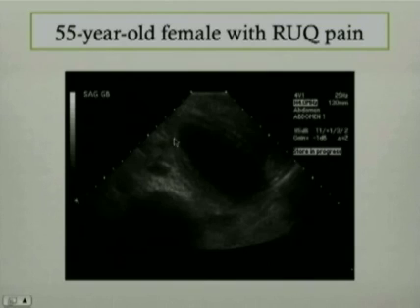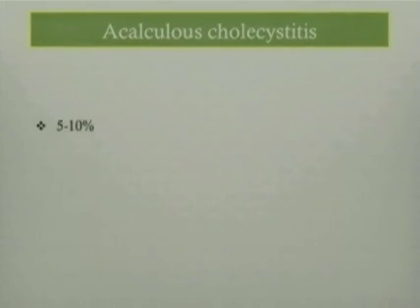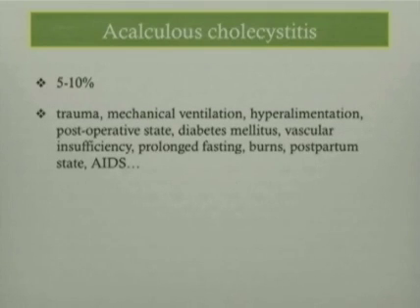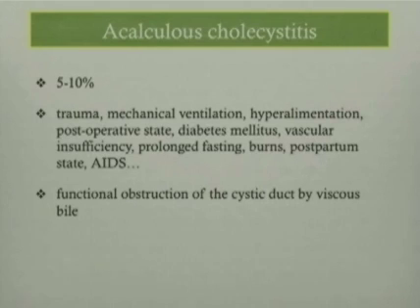Moving on to the next case in the series of cholecystitis — a 55-year-old female with right upper quadrant pain. This single sonographic picture demonstrates an inflamed gallbladder with a very thick gallbladder wall and some pericholecystic fluid. However, what is lacking here is the presence of gallstones, so the diagnosis is acalculous cholecystitis. This accounts for only 5 to 10 percent of cases of acute cholecystitis. Predisposing risk factors include trauma, mechanical ventilation, and hyperalimentation. The patient is usually very sick, and the cause is usually related to functional obstruction of the cystic duct by viscous bile.